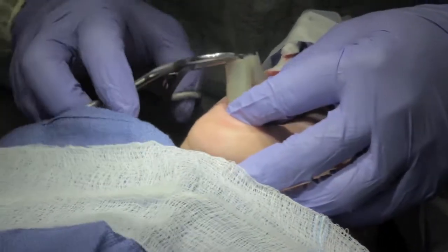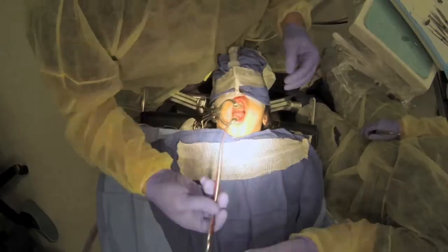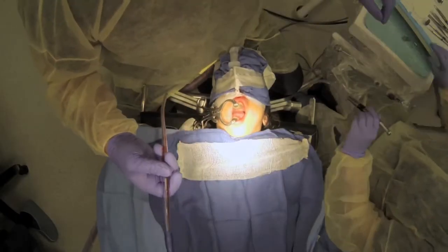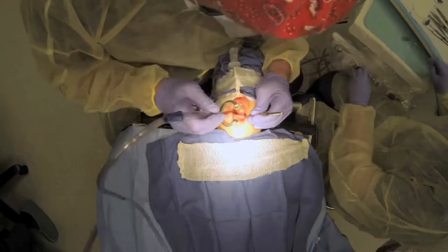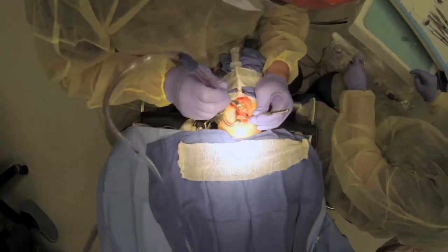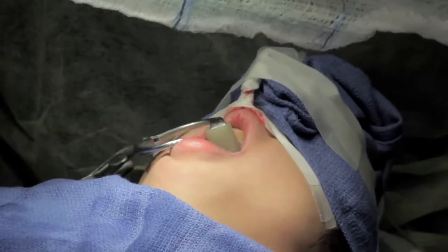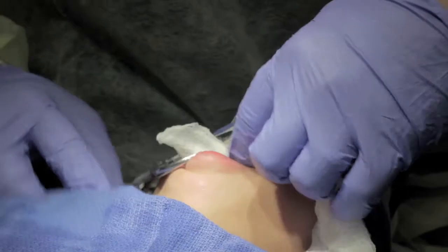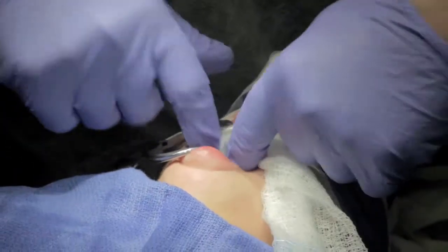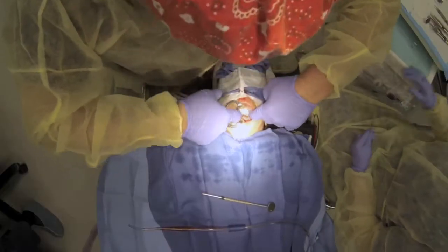Once the patient's asleep and intubated and prepped, we're going to suction any spit or blood out of the airway and we put a throat pack in — just a piece of gauze with some radiopaque strings. That prevents anything from going down the throat while we're working. The throat pack is in.